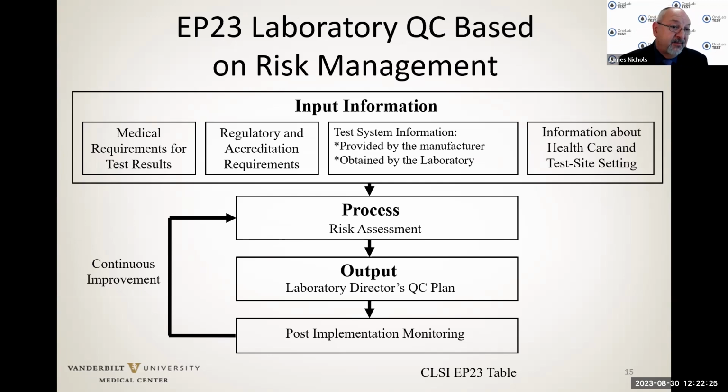We process that information through a risk assessment. Our output, as we mentioned, is a summary of our action plan. Basically, that is our quality control plan. And once we implement that plan, we're going to monitor, assess for continued errors, and continuously improve this process.